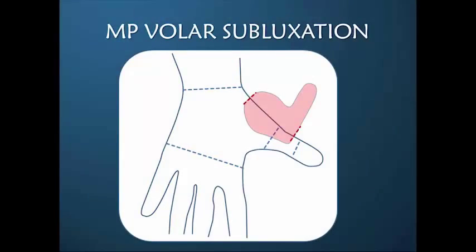To construct this so that you're able to open it, to slide it over what is usually a larger IP joint.